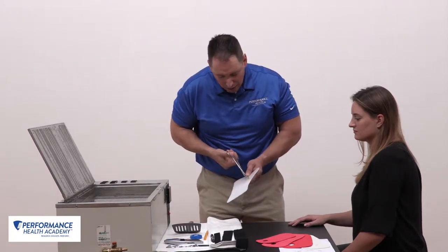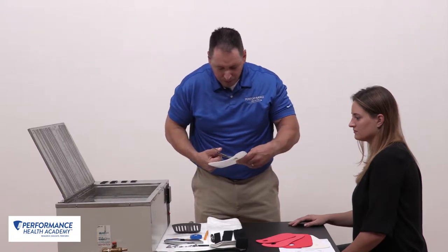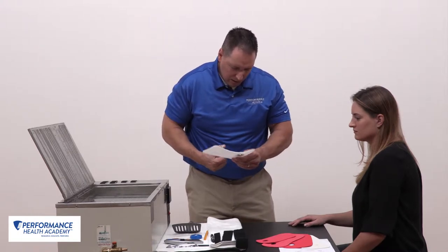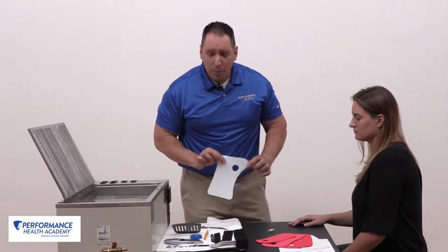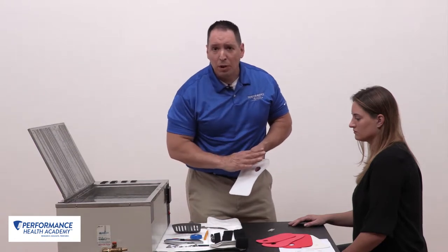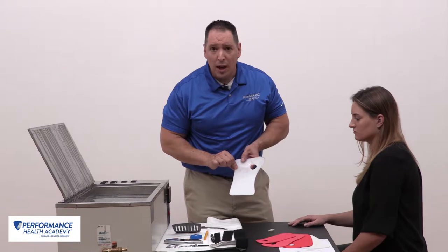Then from that point, I'll stick those scissors in and create my hole. And there I have my thumb hole cutout. Some people will start that with a hole punch; some people will use a heat gun just to get it soft and then push the scissors through. But this is an effective and efficient way to do that as well.